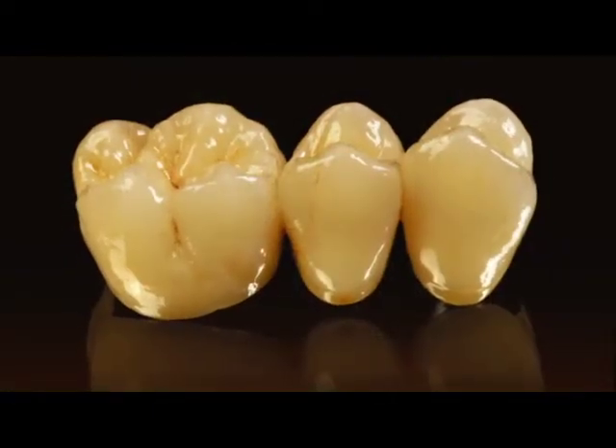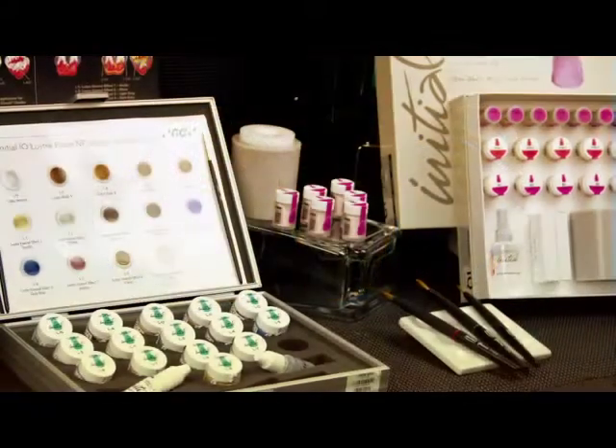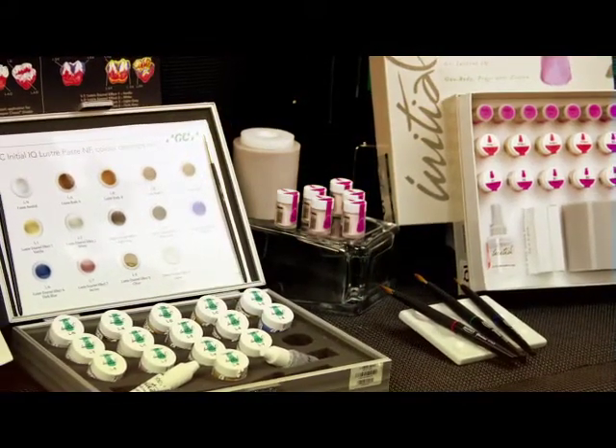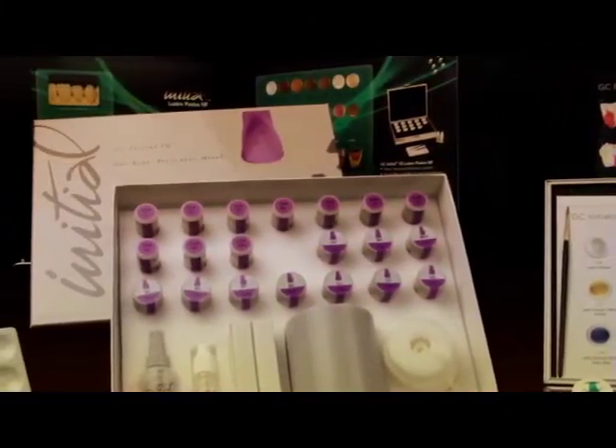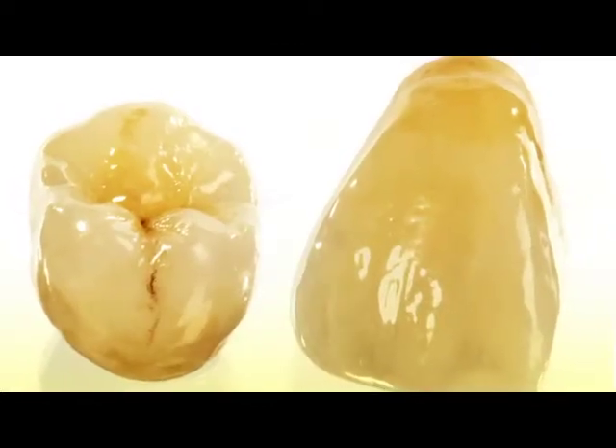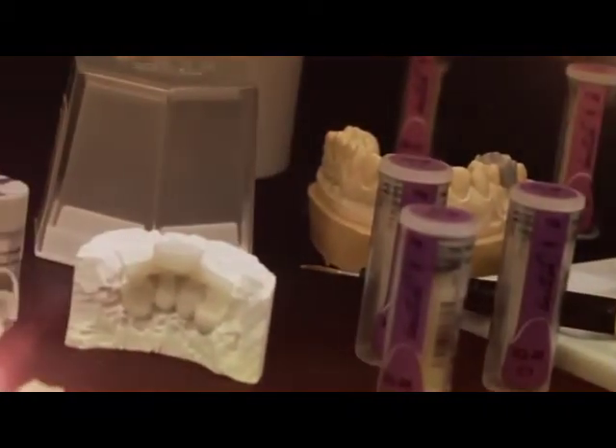GC Initial IQ — the new one-body press-over metal and press-over zircon systems — are feldspar-based pressable ceramics that demonstrate unsurpassed lifelike aesthetics in no time. The totally new technologies of pre-blended ingots and the GC Initial IQ three-dimensional luster paste add up to an internal light dynamic which exhibits unrivaled vitality and natural luster. Both systems are ideally suited for the fully anatomical contour pressing. Although the cutback technique is perfectly possible, it is no longer necessary to achieve ultimate aesthetics. This revolutionary new system is extremely easy to learn and easy to use.